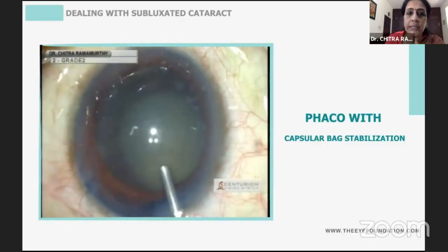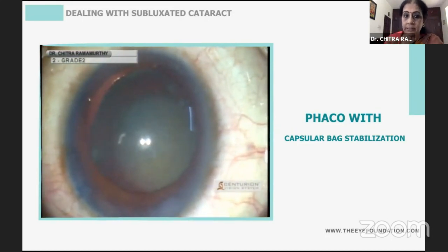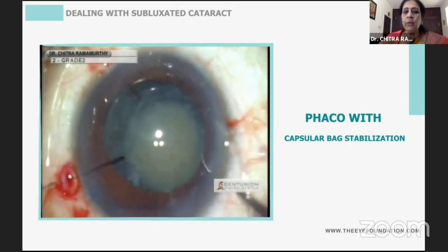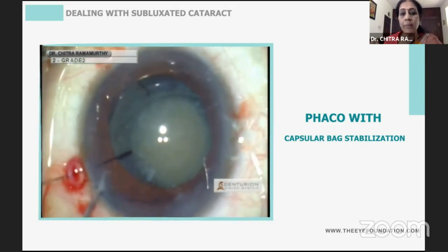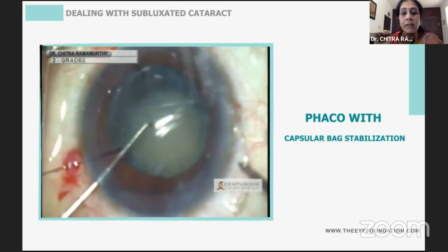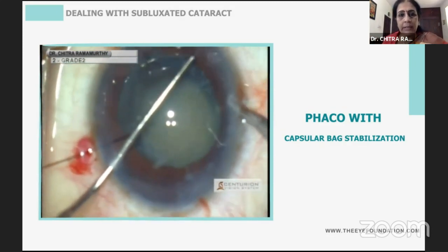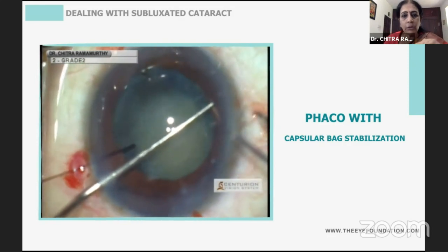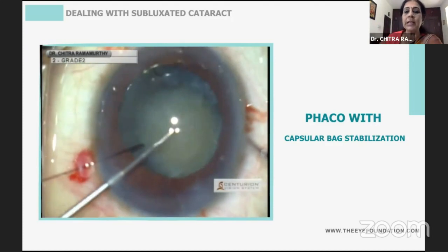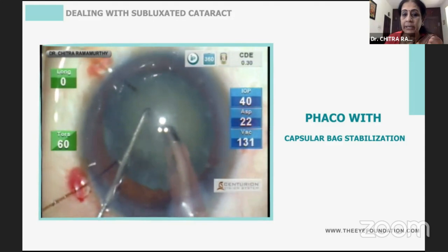You can see there's at least three to four clock hours of dialysis, a dense cataract, not much epinucleus. I'm going to place a capsular hoop to provide the anterior-posterior support, then push in my CTR through the side port. I keep a second instrument, and towards the end of the CTR insertion, I hook it and push it into the capsular bag so it is not overlying the zonules and is properly buttressing the bag.